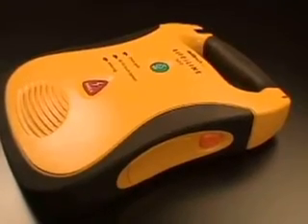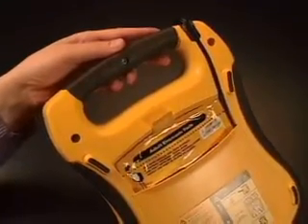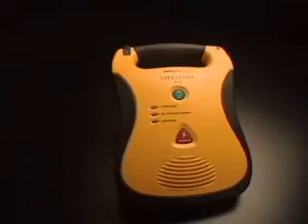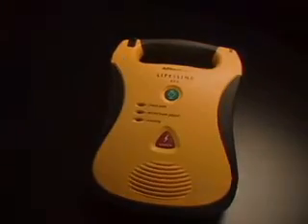Lifeline AED should be kept with the battery pack inserted and the pads connected and stored in the pad holder. The unit should be kept in a readily accessible location with the active status indicator visible.